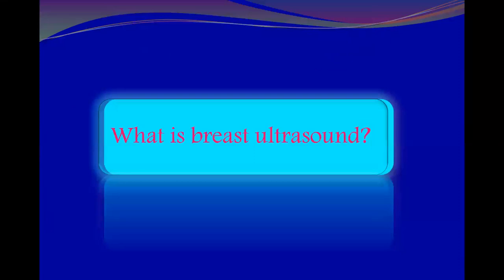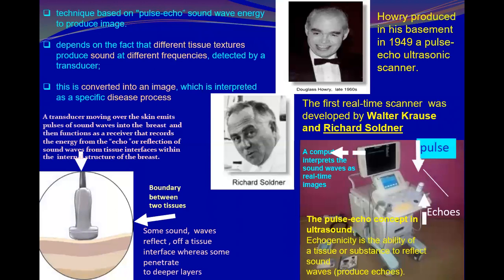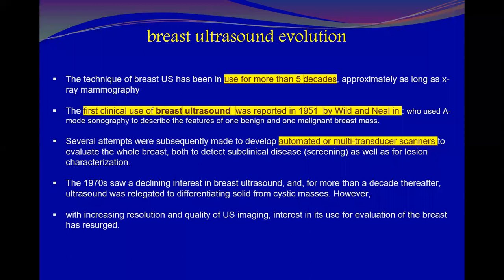So what is breast ultrasound? Breast ultrasound is the use of medical ultrasound or ultrasonography to perform imaging of the breast, having the same concepts of medical ultrasound, okay, using the same machines. And it started about 5 decades earlier, as long as mammography. And the first clinical use of breast ultrasound was reported in 1951 by Wild and Neal, okay? And thereafter, subsequent development of breast ultrasound occurred.